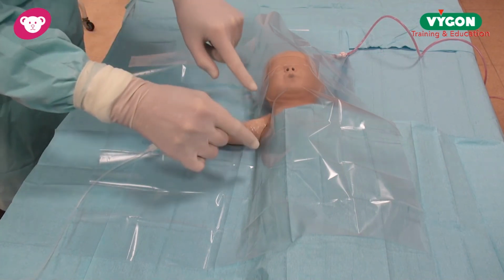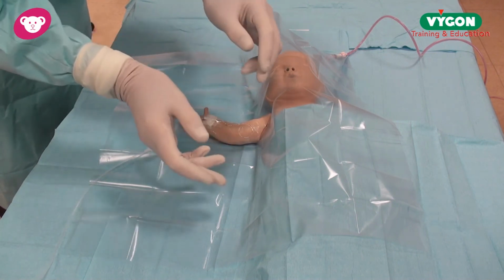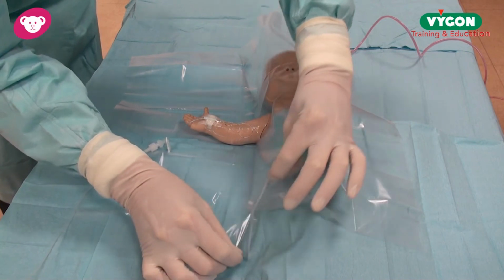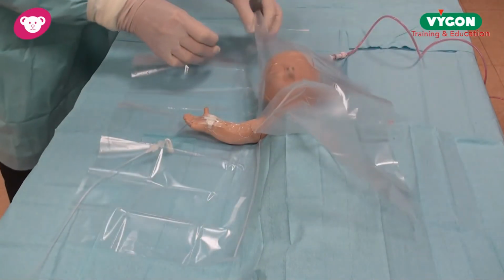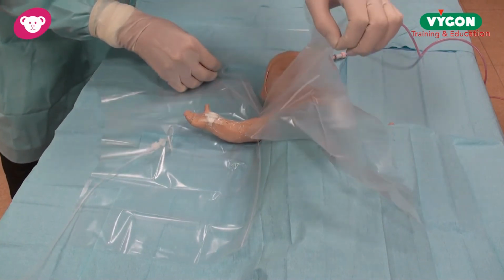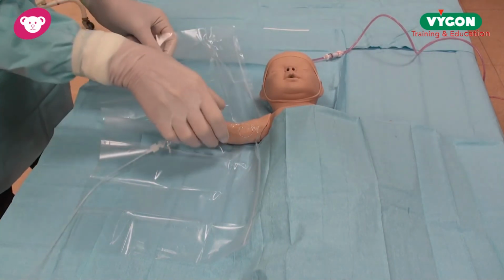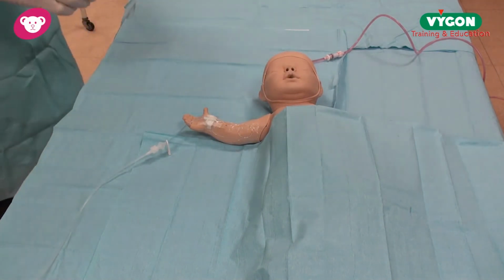One of the wonderful benefits of this new drape is that you don't have to cut it with scissors or pull it apart. This one actually peels apart, and I'm going to show you how that happens. You peel from this end, and then from the opposite end, and that's now completely removed from the baby, and that's the PICC placement completed.